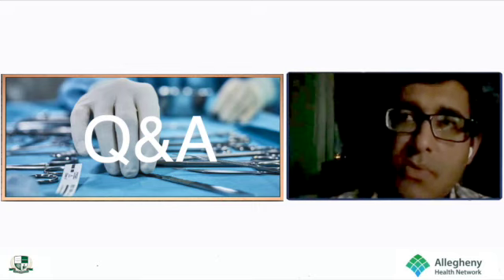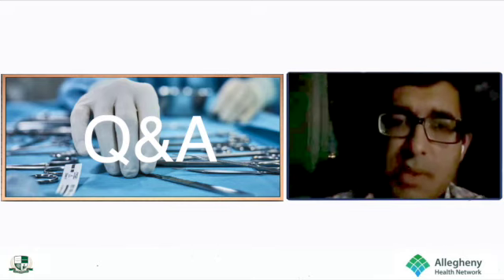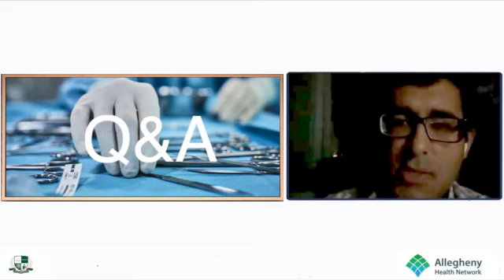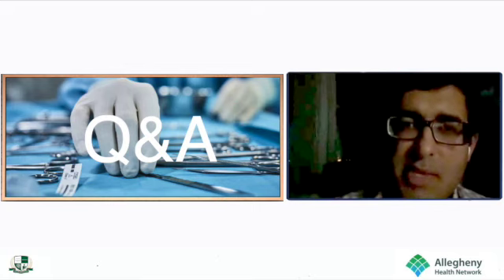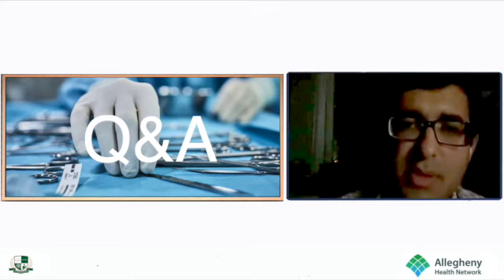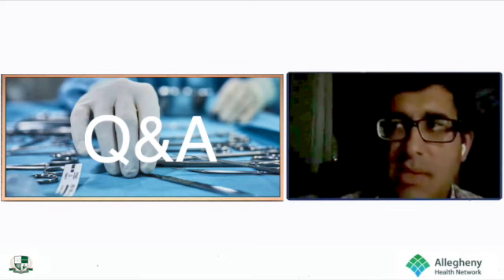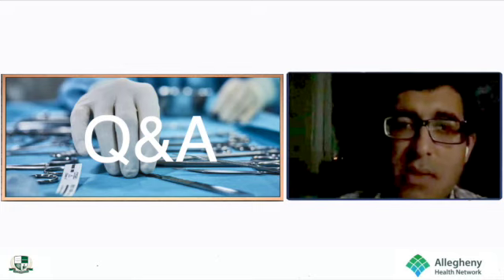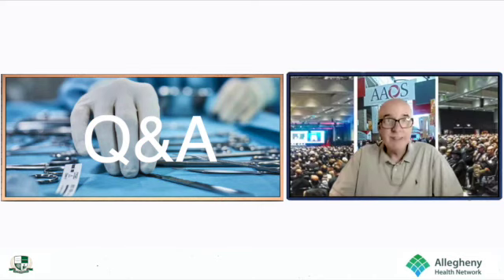For someone who is just taking it up for the first time, there probably is a bit of a learning curve, because there are a lot of little tricks and important things you have to pay attention to, to make sure that the robot is acting safely. That is a key point. A few millimeters here and there, depending on even how much pressure you put on things, can make a big difference. I think the best way is to spend a few cases with someone who's done a lot of these cases, and then start on your own. But probably Dr. Lieberman can say a bit more on that.